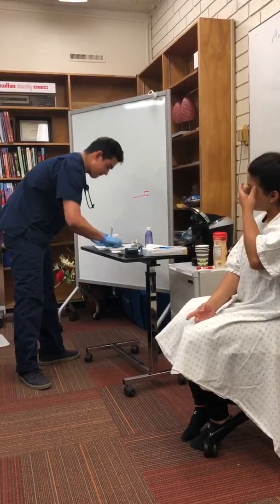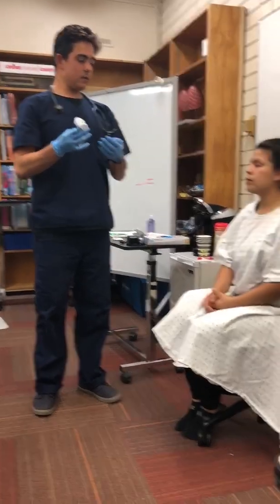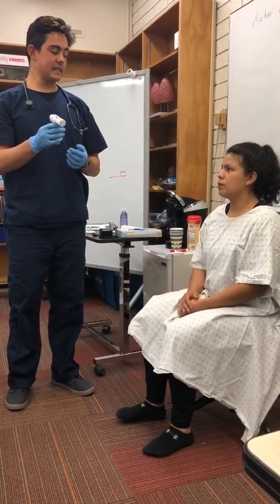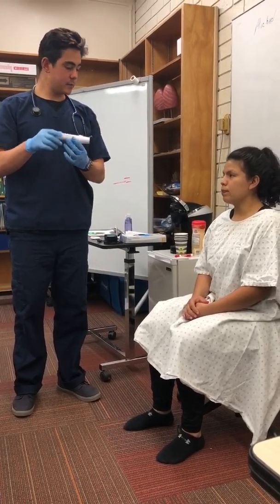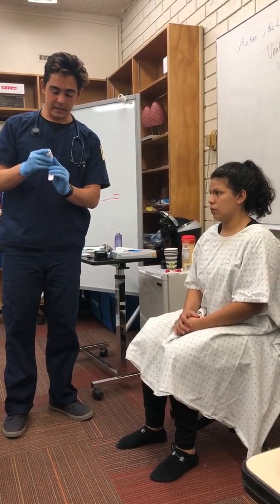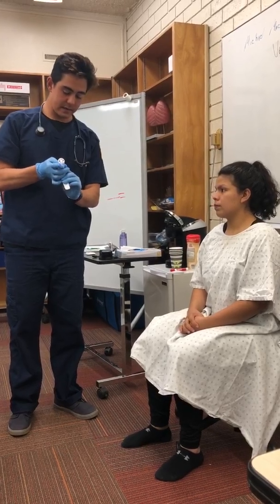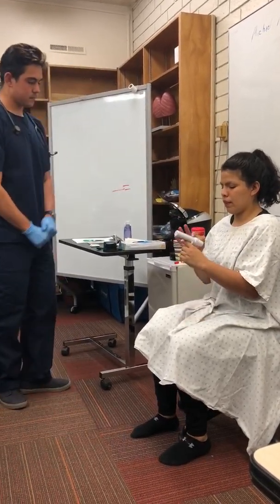418. So when we do this, we want to sit upright, feet on the ground, good posture, shoulders back. We're going to take a nice deep breath in and forcefully exhale through this hole, lips pursed around. And we're going to mark with the green 418. The best of 3 results we'll take, and then we'll compare that for your percent. Go ahead and blow. We're going to do 3 results.